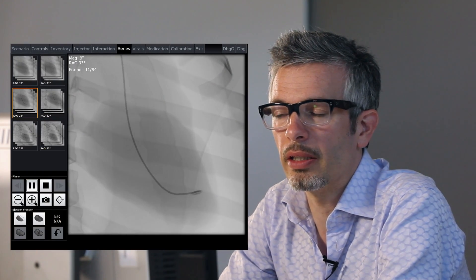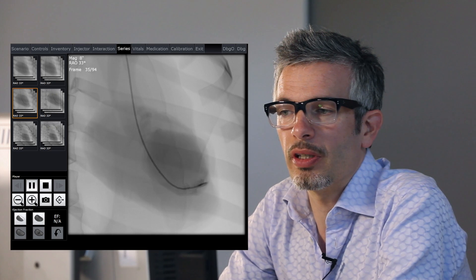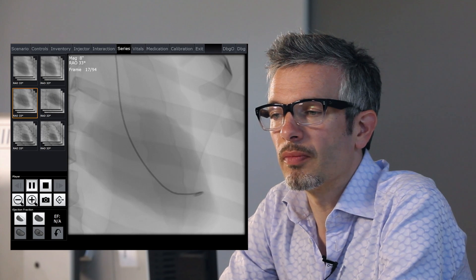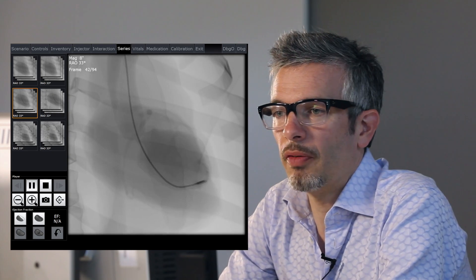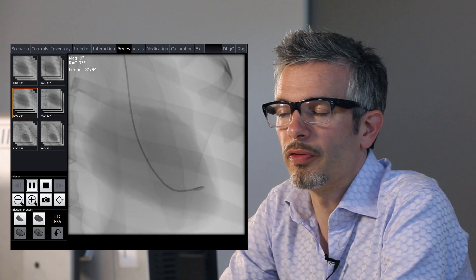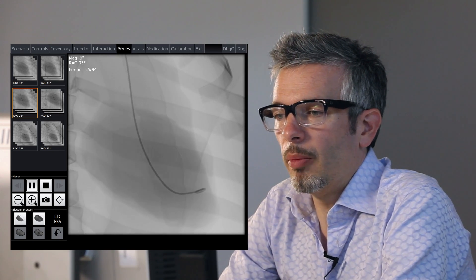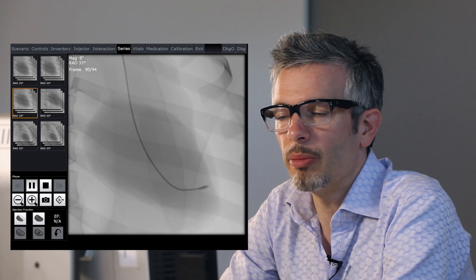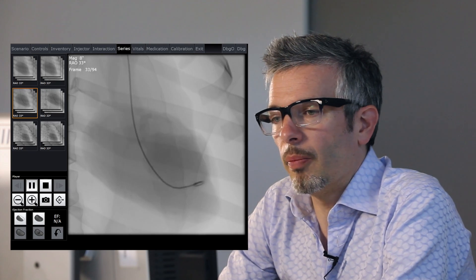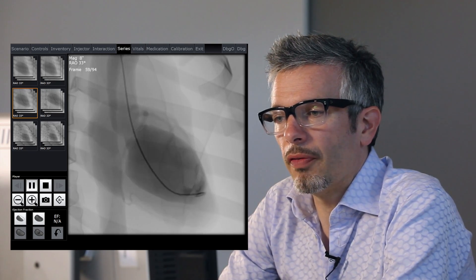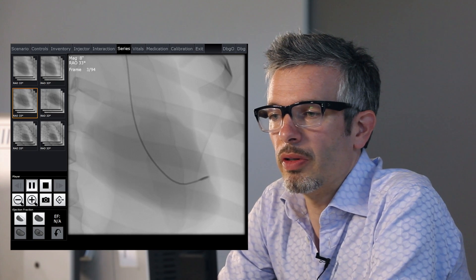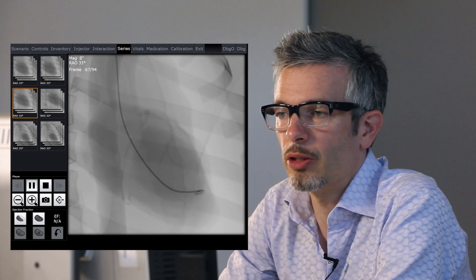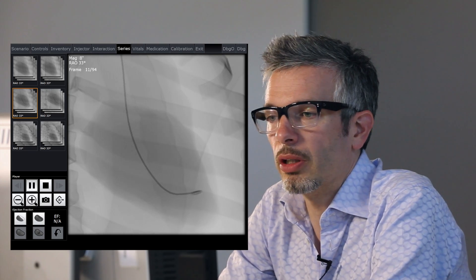What we've done here is taken a pigtail catheter across the aortic valve and placed it in the apex of the heart. You have to be careful as you're coming across the valve — it can sometimes take a little bit of patience. The key thing to look out for is that you've not crossed through the mitral valve apparatus. If, as it is here, you can advance the catheter into the apex, watch out because that can sometimes give you a lot of ventricular ectopy, which can make interpretation of your left ventricular gram difficult.